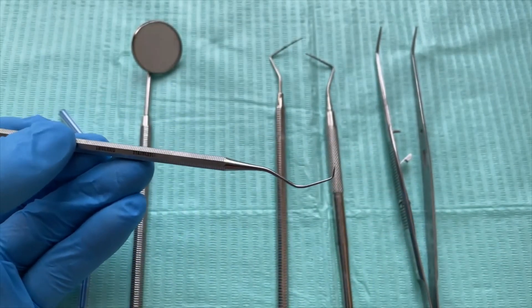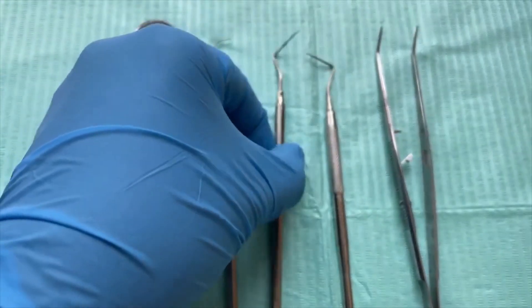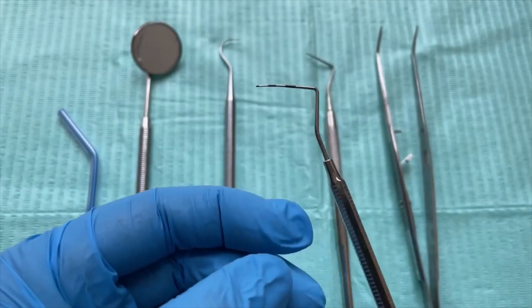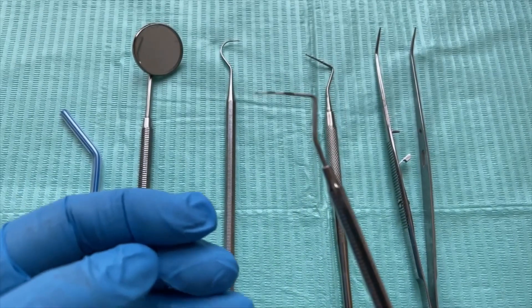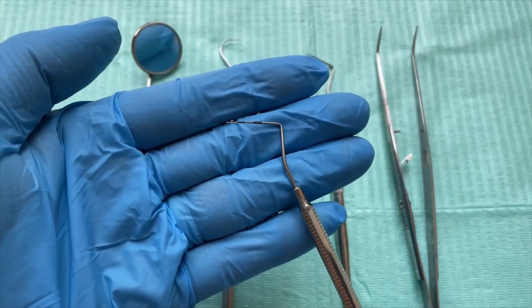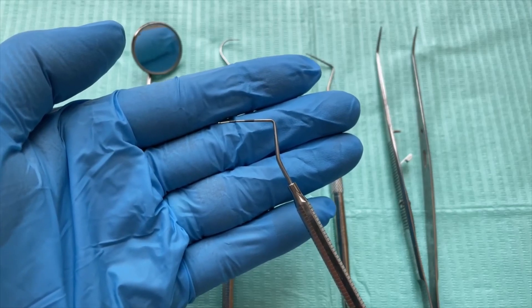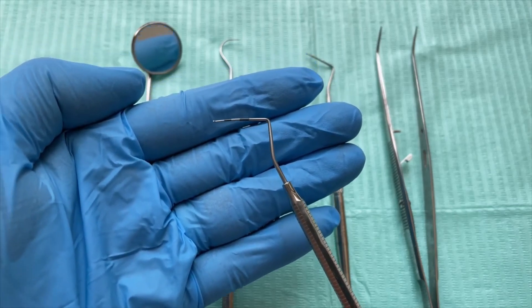And we have a BPE probe. BPE stands for Basic Periodontal Examination probe. You can see those black shading there — this is used to check the gums.